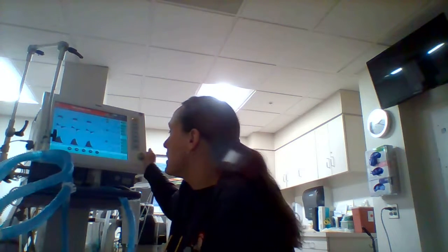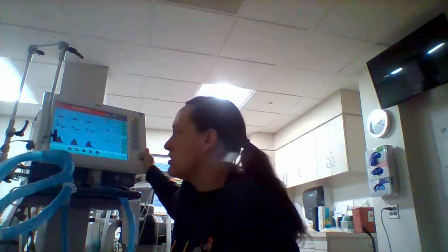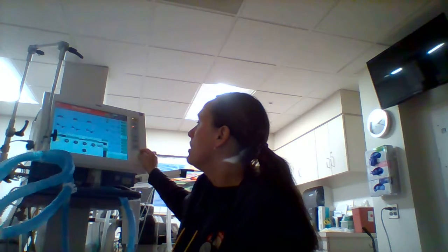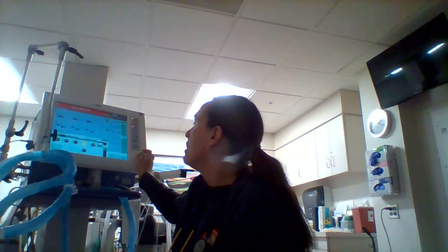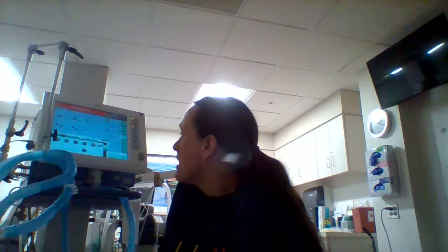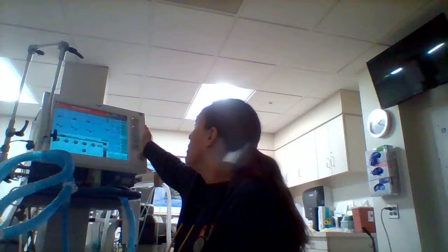So let's say that they send him to CT and they realize that he doesn't have any kind of internal brain injury. It's just an outside. So we're going to change some settings. We're going to drop his O2. Let's drop it to 90. Frequency, we're going to drop that down. Let's go 15. And we're going to watch that. We're going to watch the patient, see how they tolerate that. And every time you do a change, draw an ABG. Every time you do a change, document it in your charting.